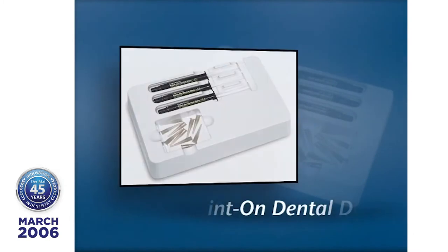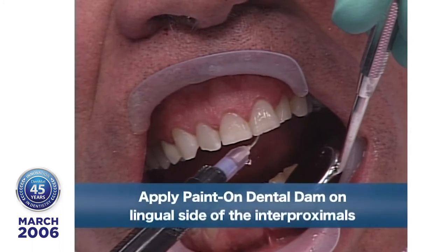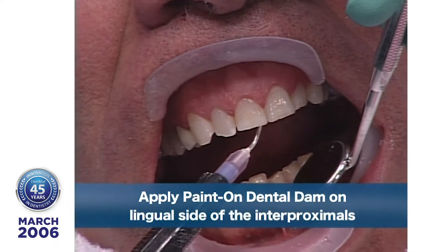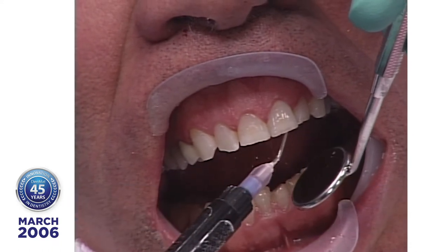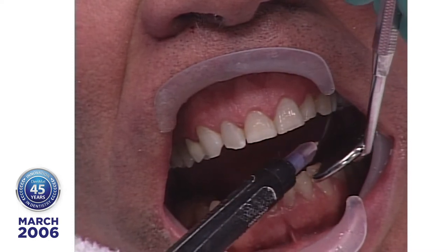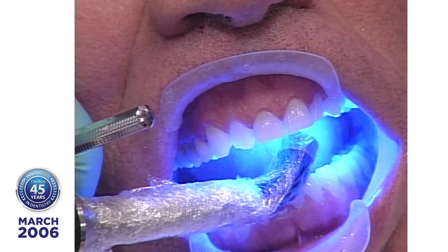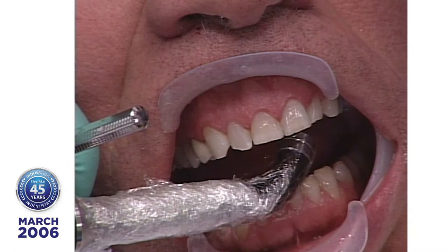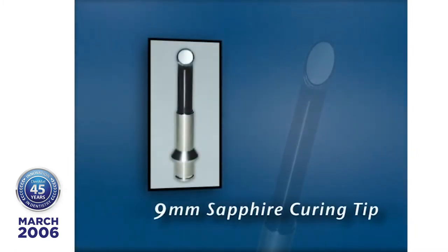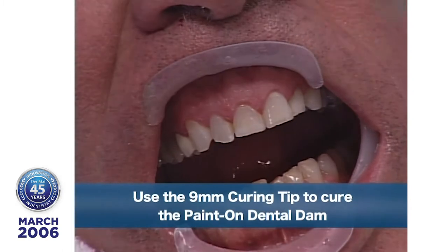And one of the things that's going to make it easy is I'm going to put some paint on dental dam all over the surfaces of the tooth where I don't want the ultra bond to bond to the tooth. And so put that all over here. And I like to put it on the occlusal of the bicuspids. Close your eyes. Take the 9 millimeter tip about an inch from the surface, and I'm applying paint on dental dam on the lingual side.